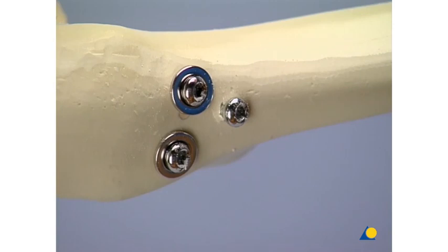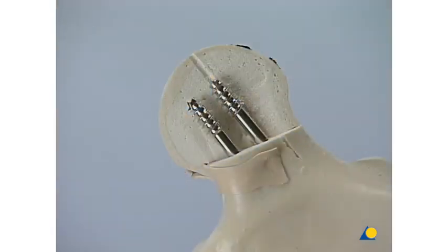Inspection of the screw position in the femoral head. In fact, the screws could be even a little longer.